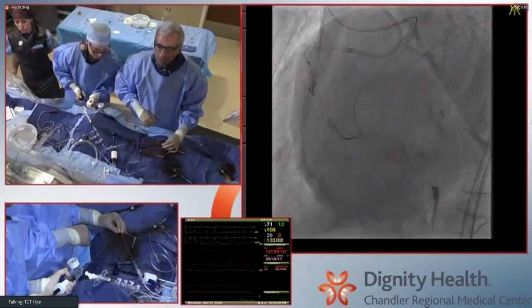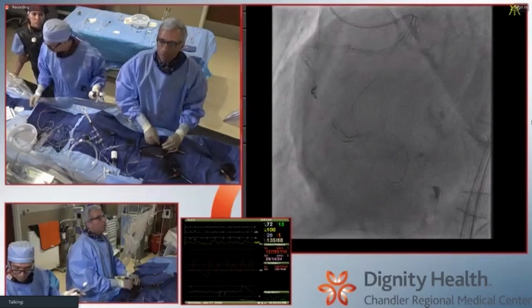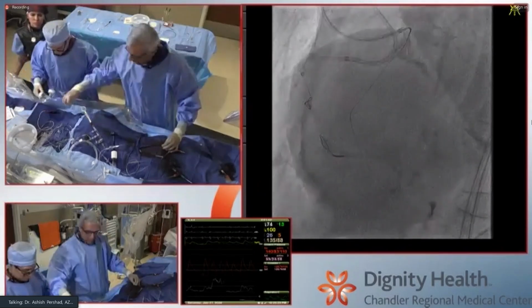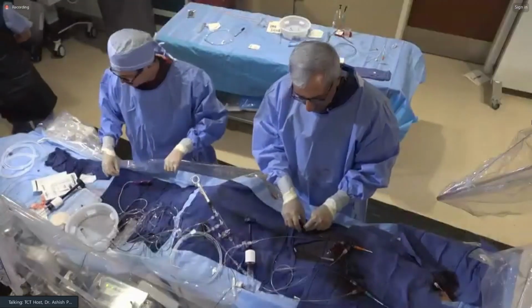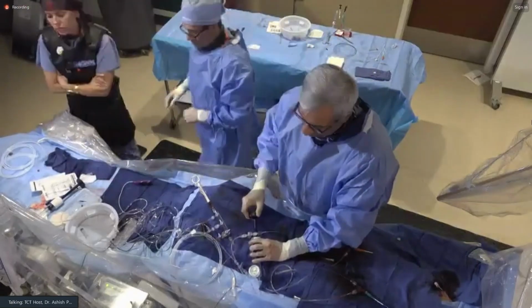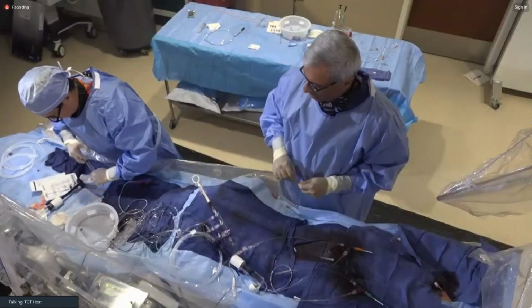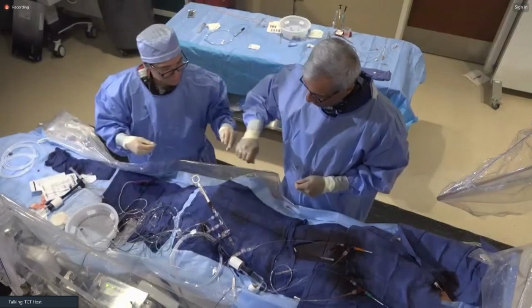That's an interesting discussion. So do you have any 9-gram tip wires on your shelf? For me, no. Me neither. I don't really understand the usage case for those. Because the Gaia Third is going to give you a tip load in the 6 gram range, right? And so it's a very gentle step up going from 6 to 9. And then if you're actually going to go to a penetrative wire, in our lab anyway, we tried to get rid of all of the 9-gram tip wires because we find that they're sort of in between.